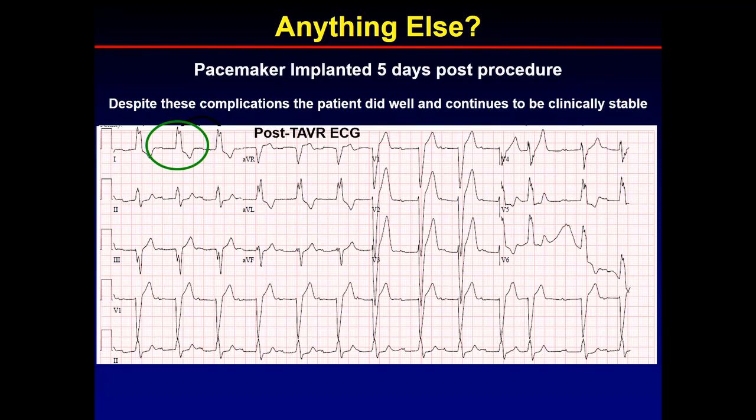So this is just an example of where not only might we use CT and TAVR as a pre-test procedure to actually look at this, but maybe also be able to merge those images in the cath lab or do maybe 3D printing to better identify who might benefit and thereby potentially avoid procedural complications. Thank you very much.